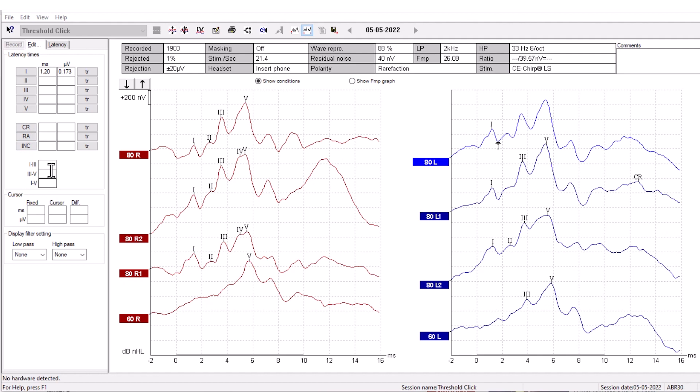Below, you can see the interlatencies, which are the latencies between wave markers 1 to 3, 3 to 5, and 1 to 5.